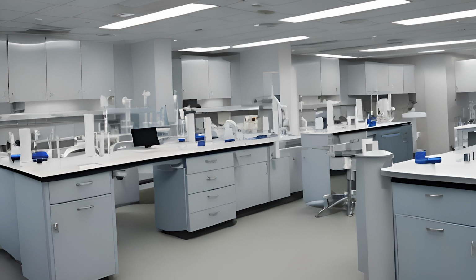If you have any special handling procedures, which we'll go over in the next section, you'll also have to follow those. That may be protecting it from light, immediately putting your tube into an ice bath. It may be that this kind of test sample cannot wait to be delivered and must immediately be rushed to the lab. It depends on what you're drawing. The last step after you do that is you're going to check their arm to make sure that nothing seems out of sorts.